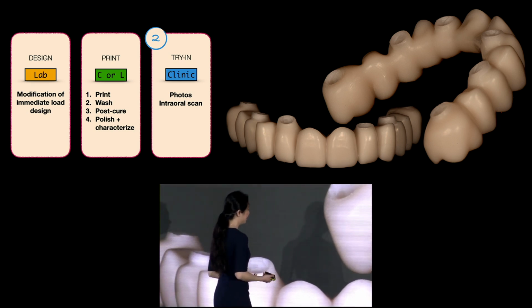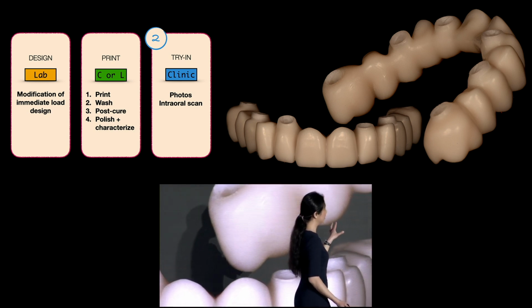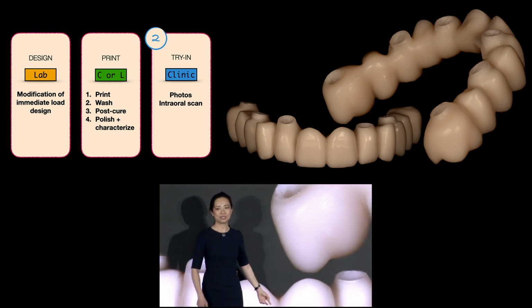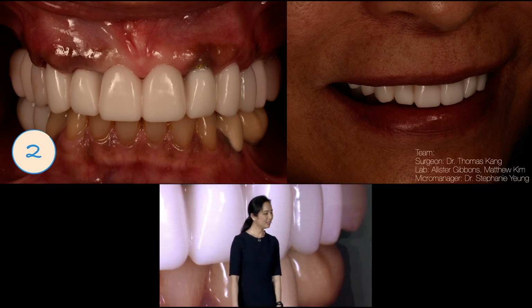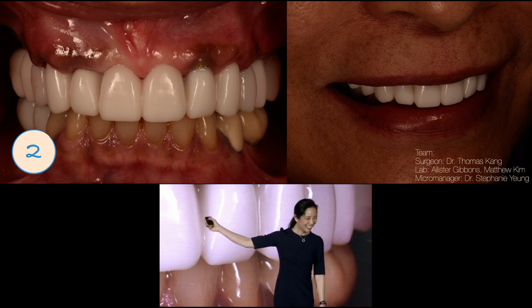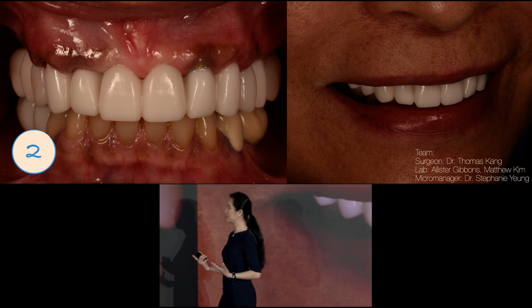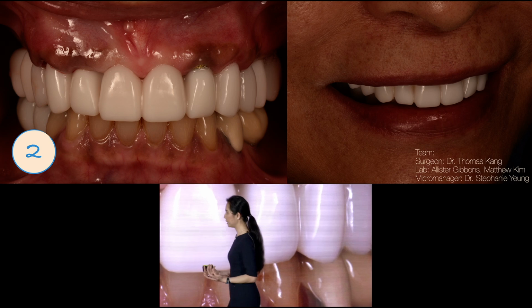It gives me the ability to evaluate the design in my hand and also see how it looks on the patient. But you can see also how nicely everything prints out now. This also gives me the ability to see the patient's tolerance of a monolithic restoration, because when you print anything, it's all one resin. Seat it in. I promise you, I did not want to give the patient this shade. This is what the patient really, really demanded. But you can see that now we have full control over where additional tissue pressure was needed and compensate for any shortcomings that we found in the provisional stage.